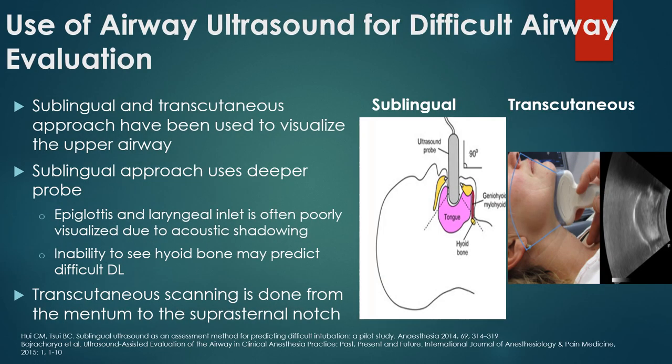Some of the uses of airway ultrasound for difficult airway evaluation. A lot of these studies are in pilot mode, or people have just been kind of playing around. They don't really have the numbers. They don't really have the outcome studies to support it. But who knows what's going to happen in the next couple of years, especially with the evolution of the handheld and the availability of ultrasound.